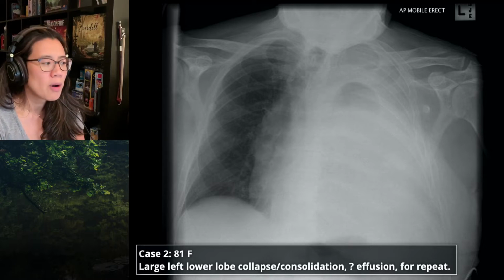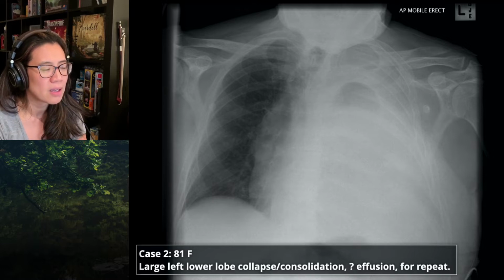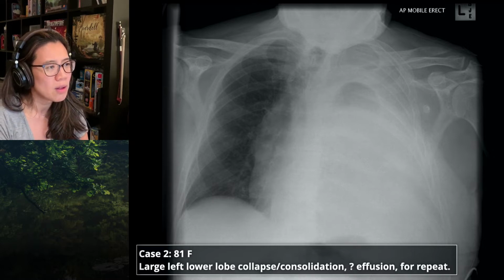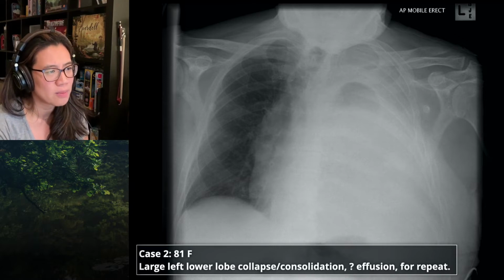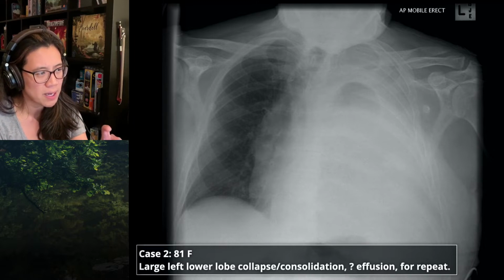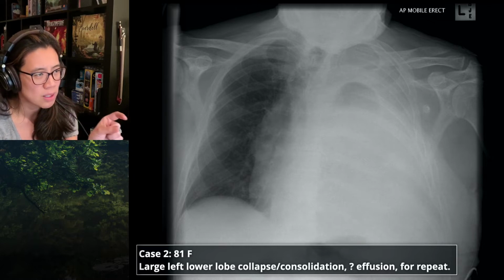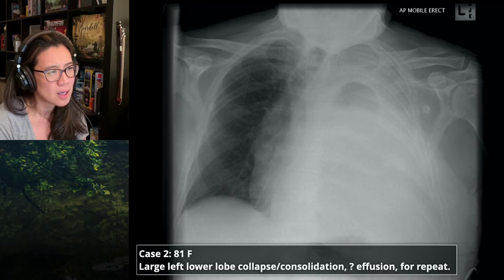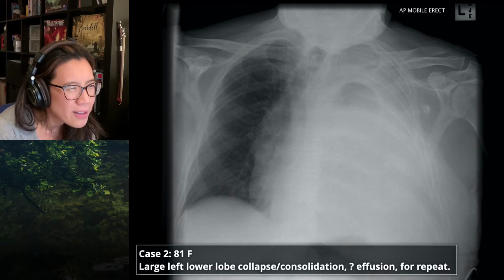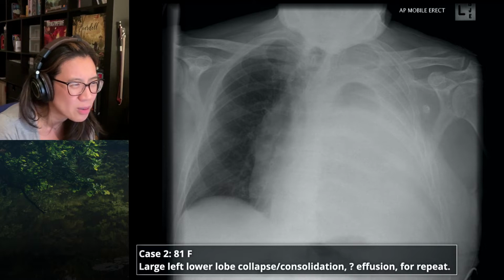Erect mobile film in an 81-year-old female patient demonstrates opacification of the left thorax with mediastinal shift to the right. Actually, yes, I think there is increased volume on the left because there is widening of the posterior rib spaces, and I do think the mediastinum is shifted, even though she's a bit rotated. The curious thing about this one, different to the last one, is this half moon shaped lucency within the left upper zone, without a distinct air fluid level within it. I can see the superior margin, but I can't see the inferior margin terribly well.